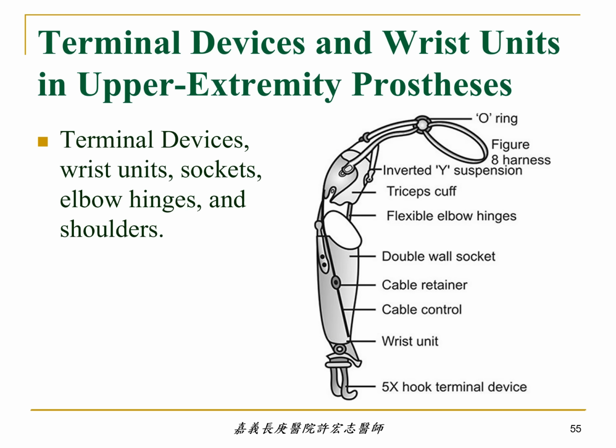Okay, let us see what components we have in the normal upper limb prosthesis. This one we call the terminal device. Terminal device means you can link this device to the prosthesis to do different functions. For example, you have a hook, you have fingers, you have a hammer like this. We call that the terminal device.